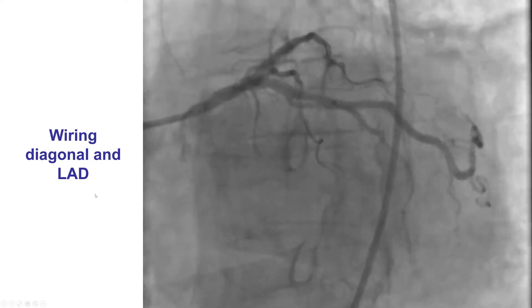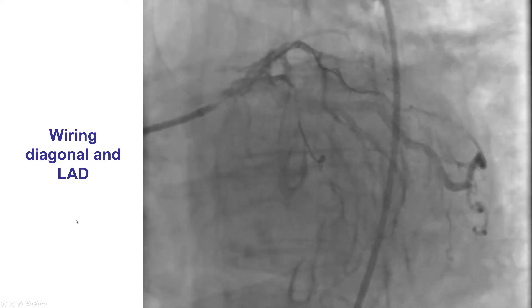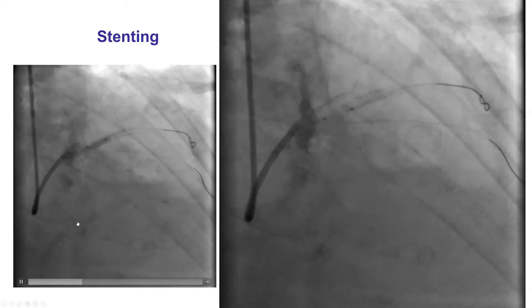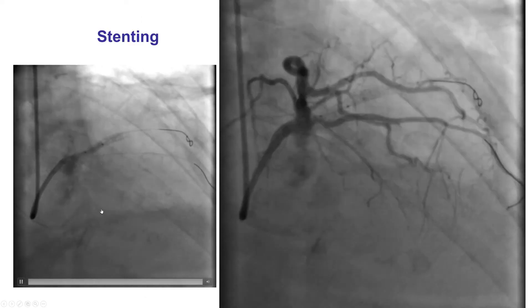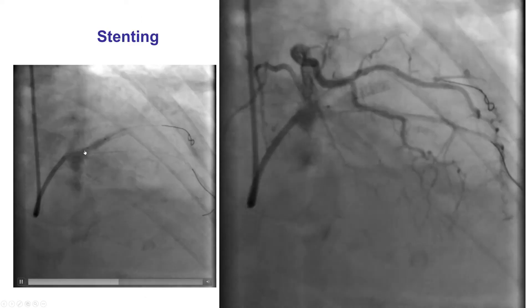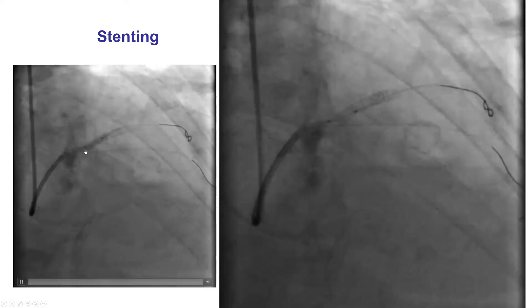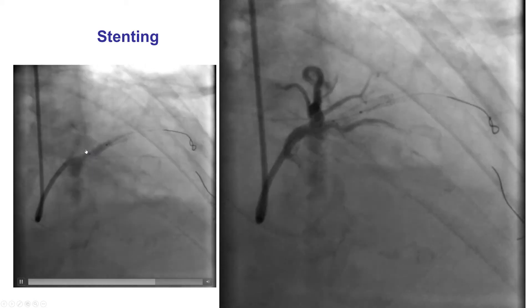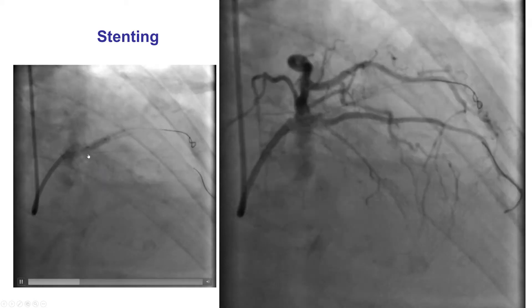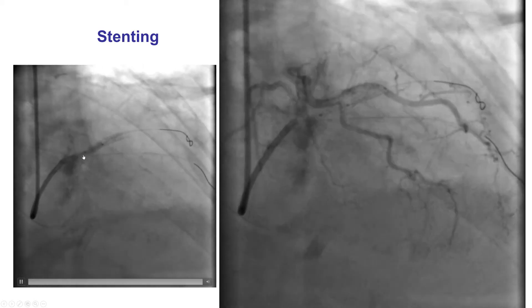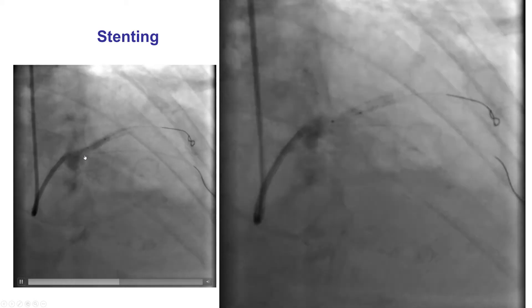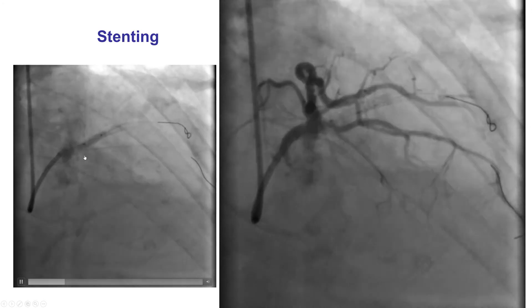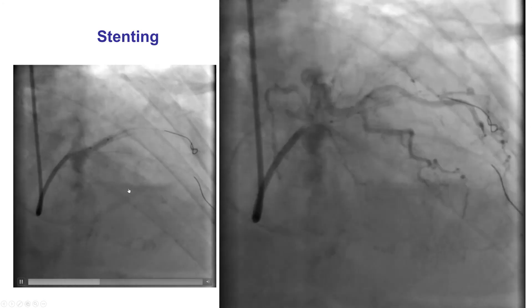Both the LAD and the diagonal were wired, and the plan was to perform balloon angioplasty and stenting of the diagonal, putting a stent just proximal to the origin of the first diagonal branch.